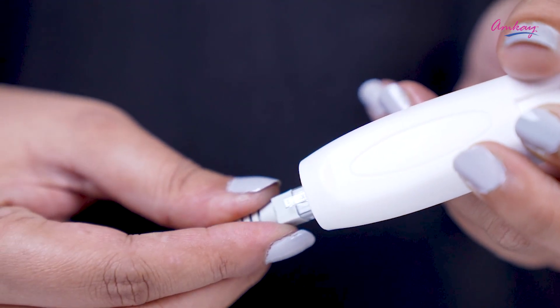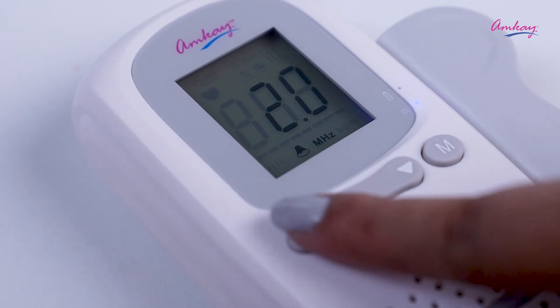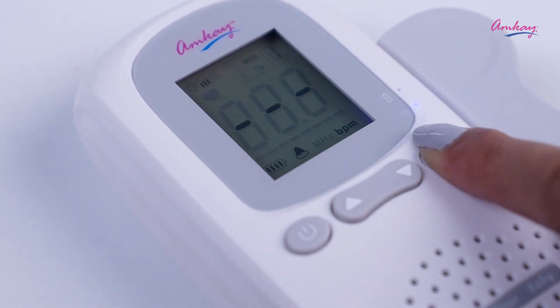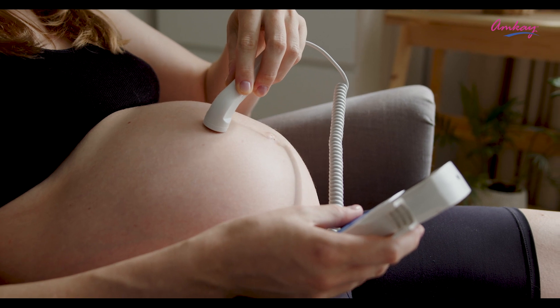Now let's see how this product works. Connect the probe wire to the probe connection port and apply gel on the stomach. Press the power key to turn on the machine. Press the M key to set the mode and menu items. Put the probe's face to your stomach and massage it gently with the gel.